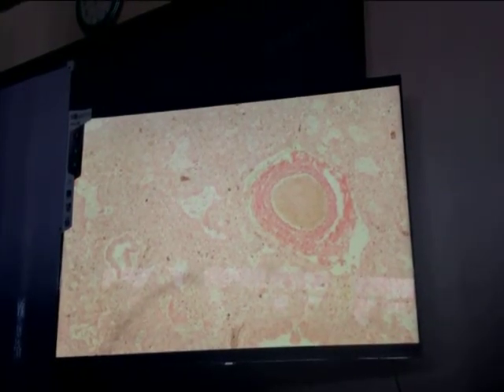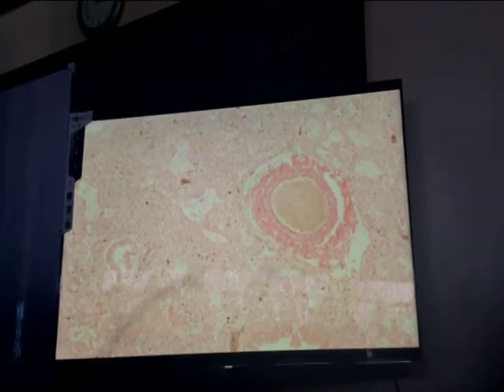Now, hyaline membrane disease develops in premature infants. So the condition is called hyaline membrane disease because you will be able to see that pink hyaline material deposited in the wall of the alveolar spaces. What will present with similar histology is ARDS, acute respiratory distress syndrome. In both conditions, the interstitium becomes inflamed, so the interstitium will appear thick, and both conditions will be characterized by increased vascular permeability. That is why there will be fluid and leukocytes inside the alveolar spaces already.